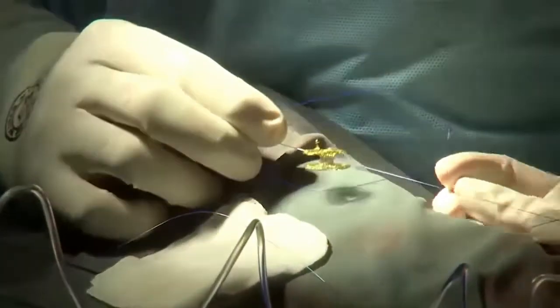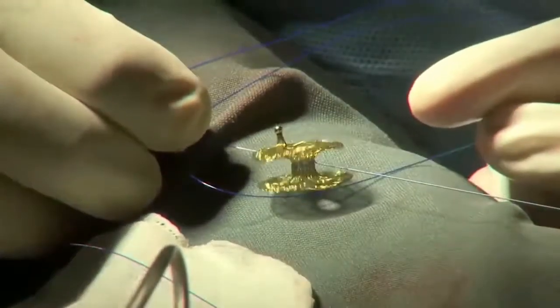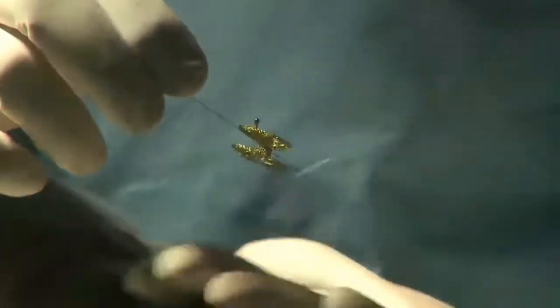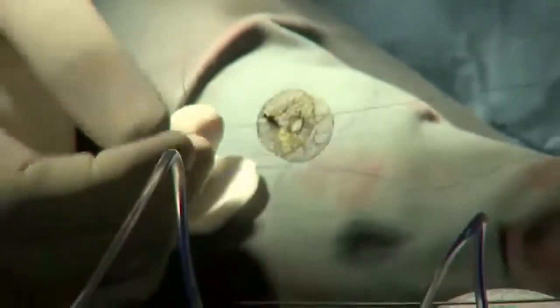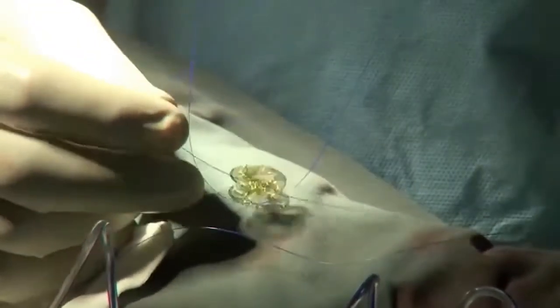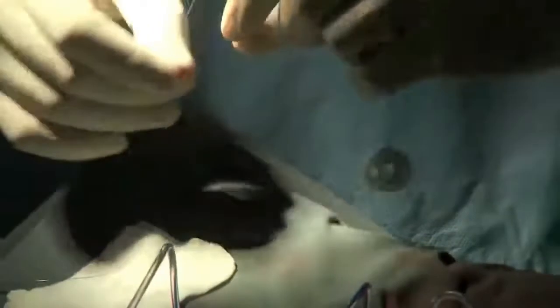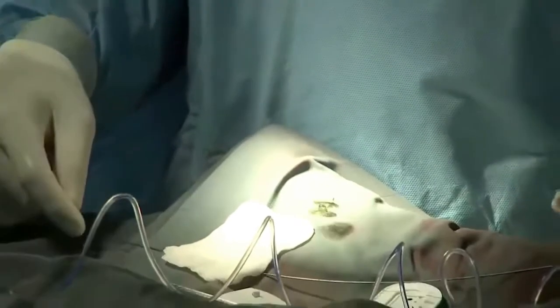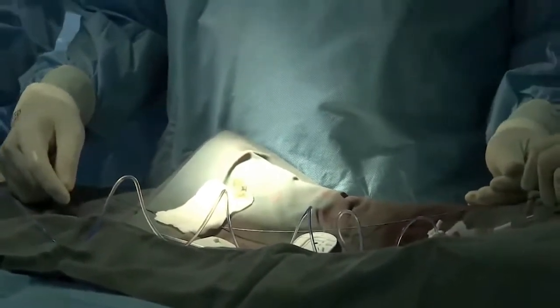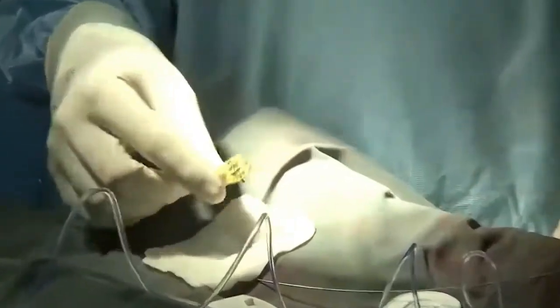And finally, a final comment: if you use this nylon thing to shrink down the hole, you increase the diameter of the device, and thereby you increase the length or the height of the device, and thereby you possibly increase the thrombogenicity. And this is another downside of this approach. You see that it's now much higher. So why don't you use the design which is a flat design, 4 millimeters, instead of creating a new thing? All right, I think that's enough nagging of the people in India. Let's go to Frankfurt. Sure, we will wait for you.